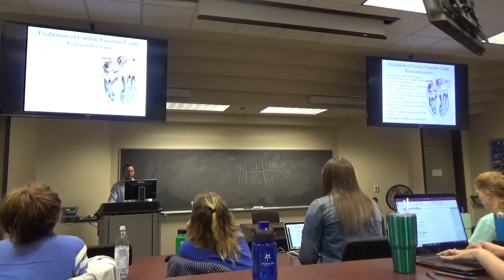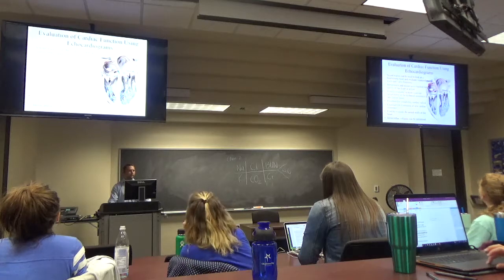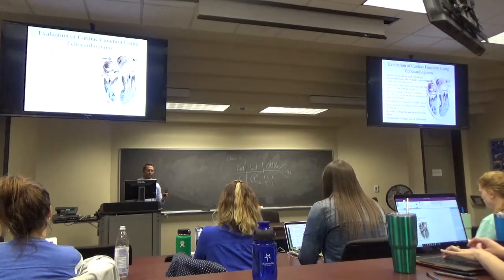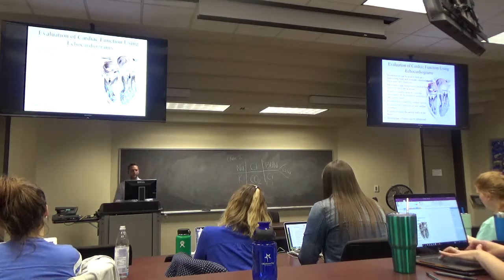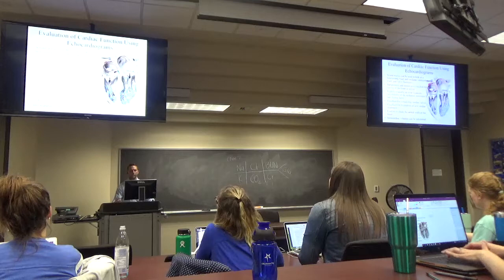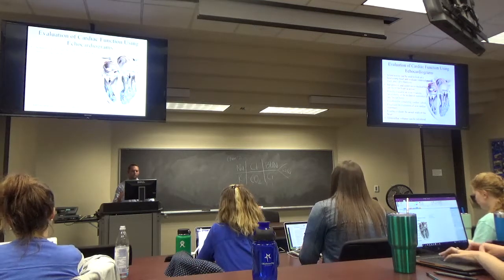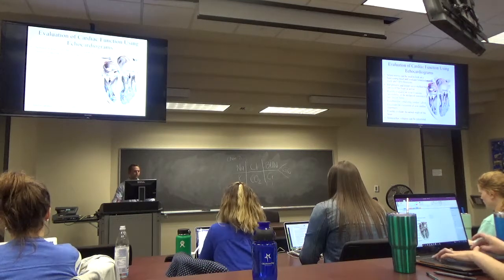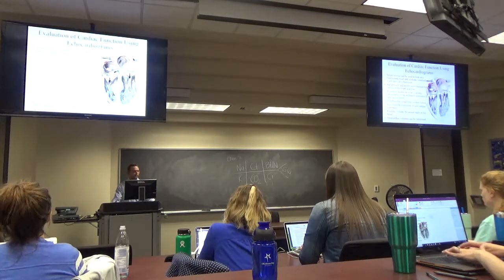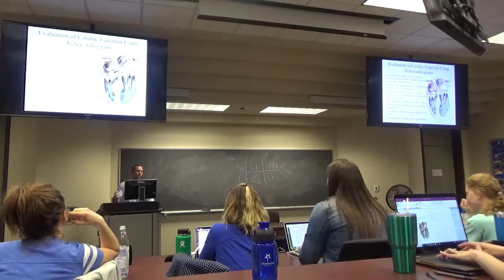This is talking about using echocardiograms. The best thing about an echo is that it gives you real-time values. You get to look at the heart. You get to see the wall motion. You get to see it contracting. You get to see it resting in diastole. So you can see a bunch of different things. The main thing is you can see ejection fraction, which you want to be over 40 to 45%. You can see whether you have diastolic heart failure or systolic heart failure. By using the ejection fraction and seeing how much the heart moves in diastole, you're able to see these things. Those are real-time measurements that can tell you if the patient has congestive heart failure.